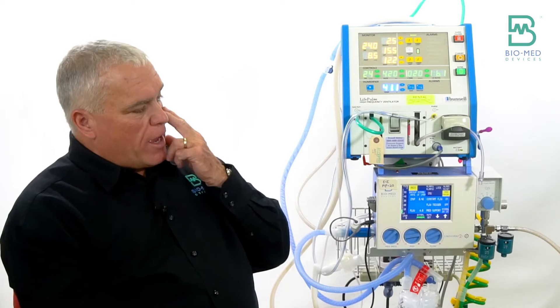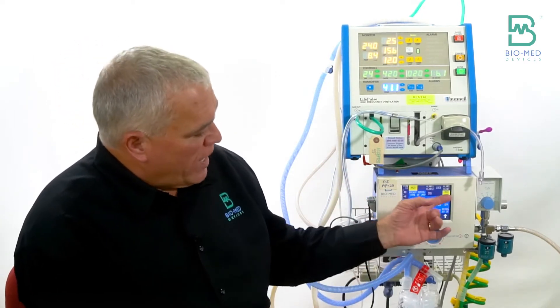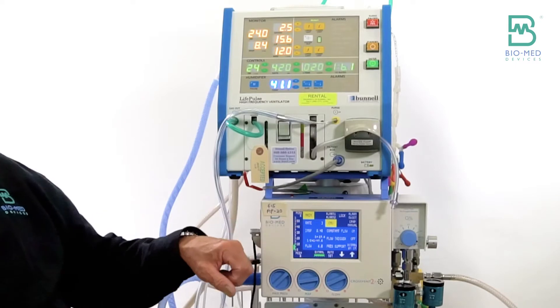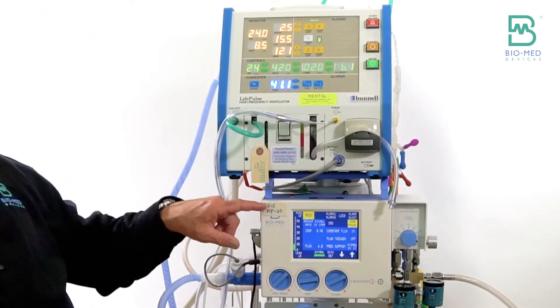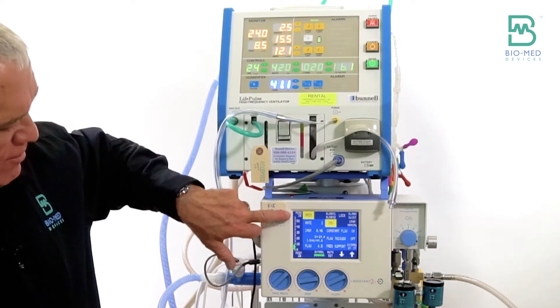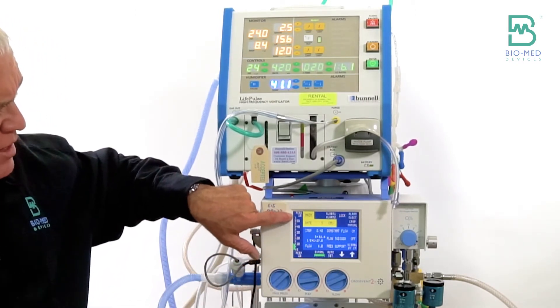When setting up the vent without a patient, you can dial the rate to 30 or 40 to get it cycling and set your PIP. But when switching from CPAP you don't have that luxury, so it makes sense to have the PIP pre-set somewhere in a reasonable range. If you set it to 20, for example, and add a notation that the rate is at five and PIP at 20, then when you make the switch you just need a final fine adjustment. Remember, you have to wait for that second breath before you can see where your PIP is.